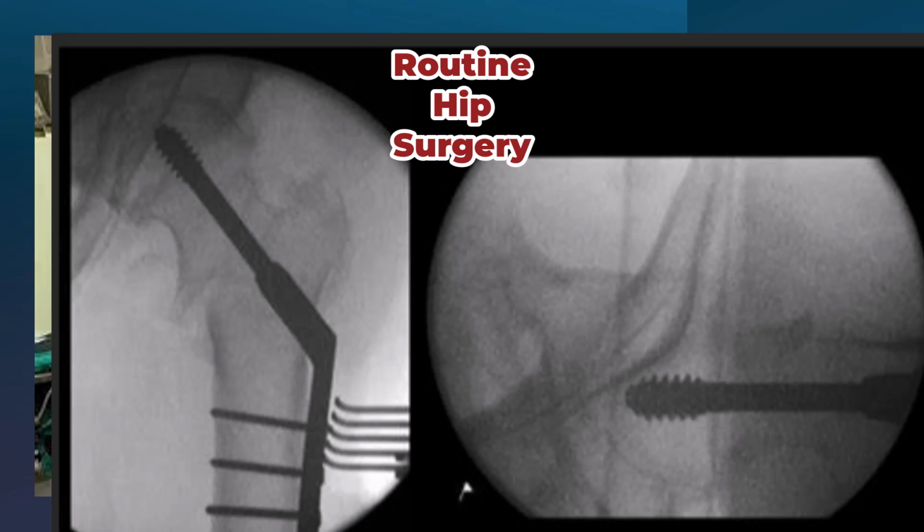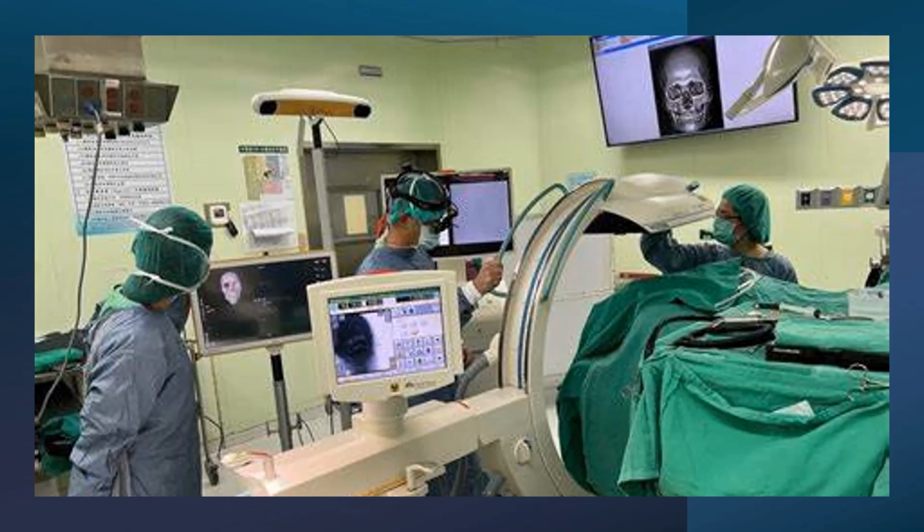Trauma and orthopedic surgeries that involve fluoroscopic guidance crucially depend on the acquisition of correct anatomy-specific standard projections for monitoring and evaluating the surgical results. The downside of this is that it implies repeated acquisitions or even continuous fluorography, which can increase radiation exposure and intervention time.